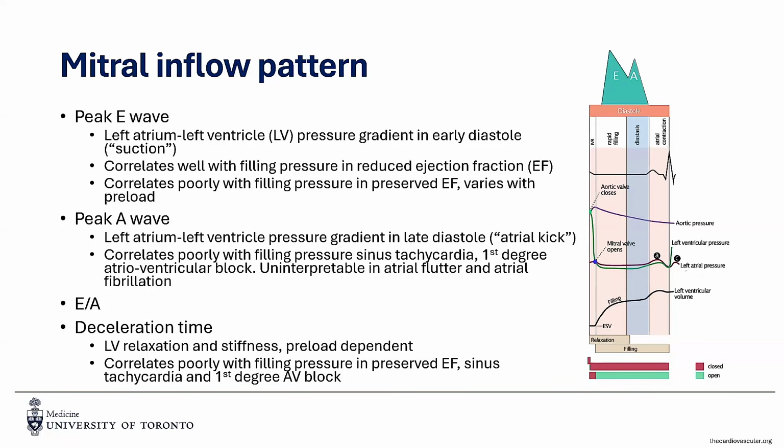is abnormally high. Like the E wave itself, the deceleration time correlates relatively poorly with filling pressures when ejection fraction is preserved. And its interpretation, like with the E and the A wave, is generally going to be compromised in situations where you have E to A wave fusion, such as sinus tachycardia or first degree AV block.